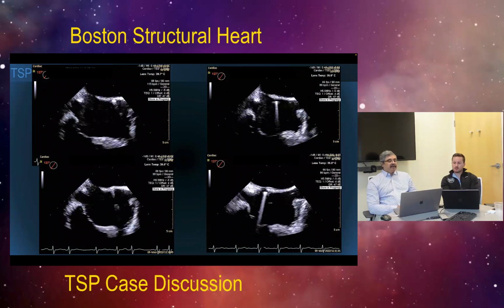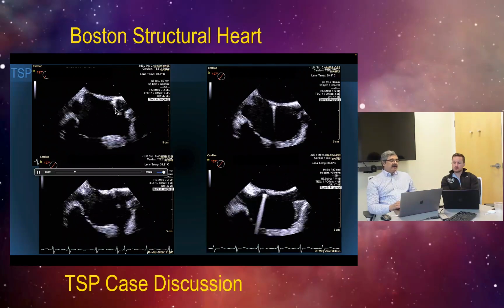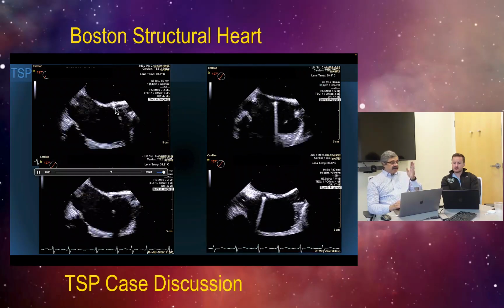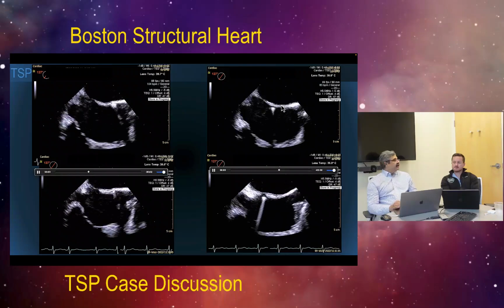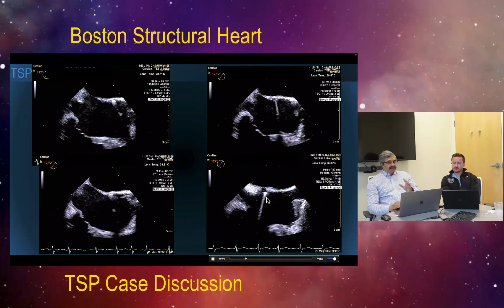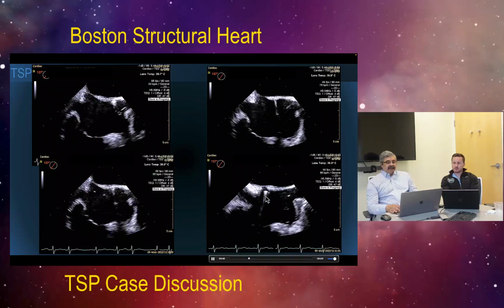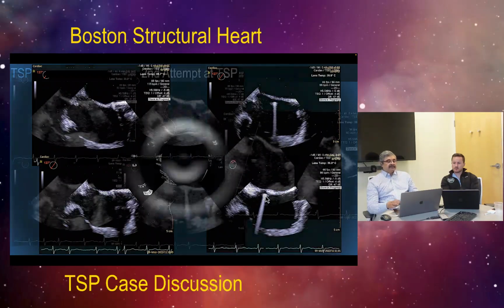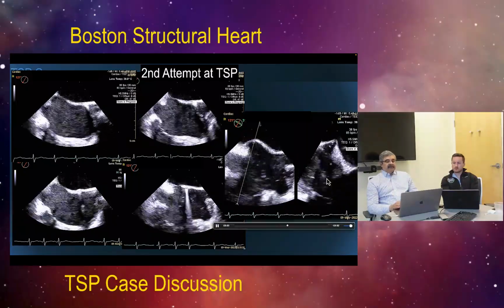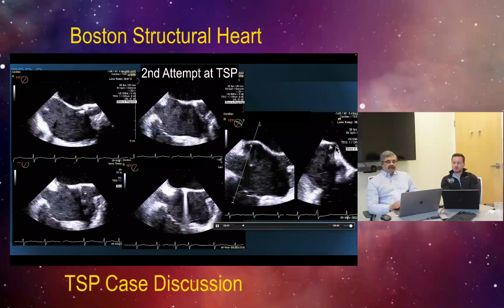Now we were a little bit more careful, and as you can see, we are tracking this indentation. And like Aidan, you pointed out, this is like one lighthouse that is available for your procedural guidance that tells you that you're not sectioning the needle somewhere in the middle, but actually looking at the tip, and that's this reverberation artifact. As you can see in this one, they brought this tip very masterfully in the middle, and we maintained this entire continuity of image without losing this imaging during the process of septal puncture. And then we tracked it back. We were able to indent. We were much more inferior, and the height or the annular distance was adequate for us.